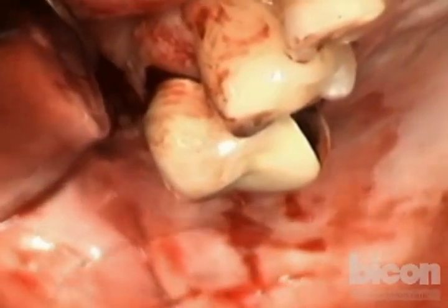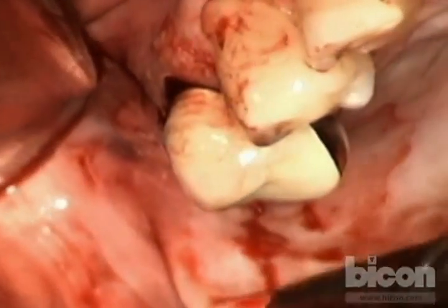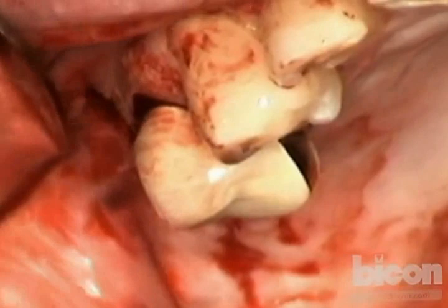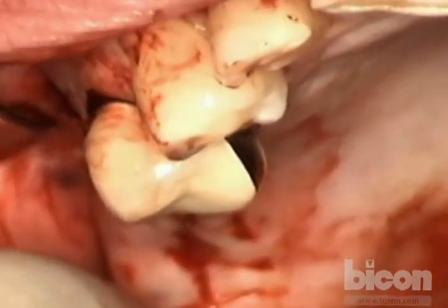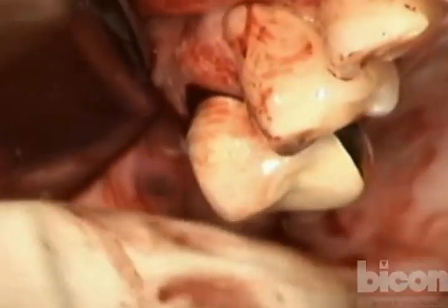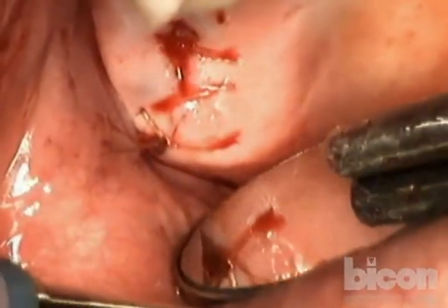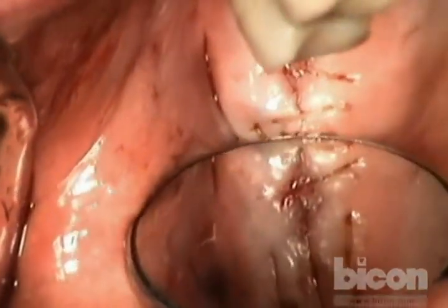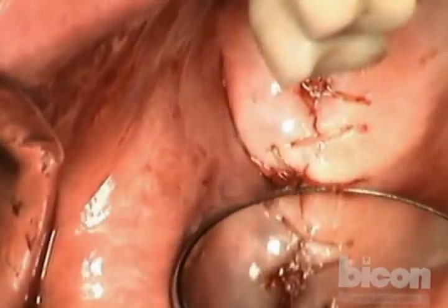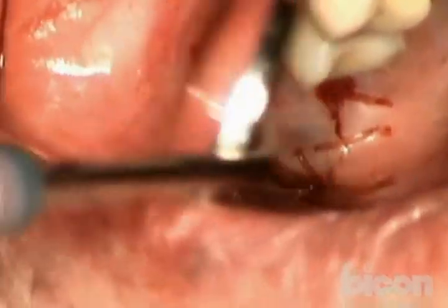Okay, we'll end the suture now. Don't be afraid of combining types of sutures that will serve the patient and the incision best. In this case, we start with a horizontal mattress. We finish with a running suture. Either way, we have closure that is tension-free and complete. So what I want you to see is this right there. Okay? And that's it. Great. Turn to the left, and that's the releasing incision now sutured. Great. Okay. I'll take questions.